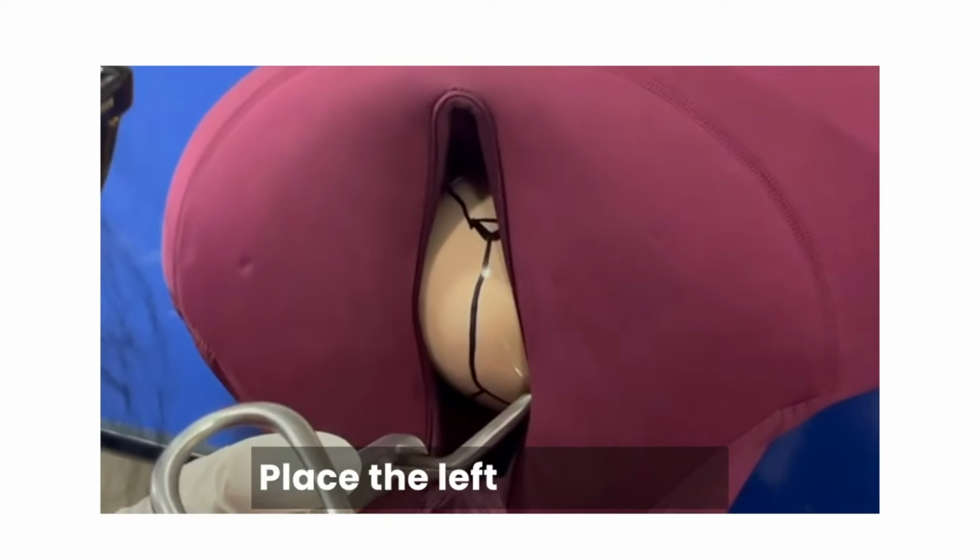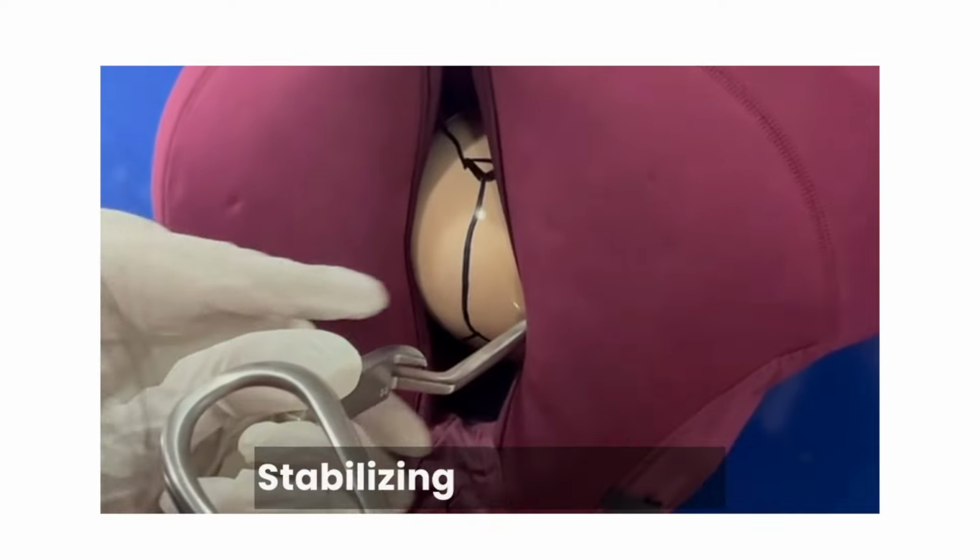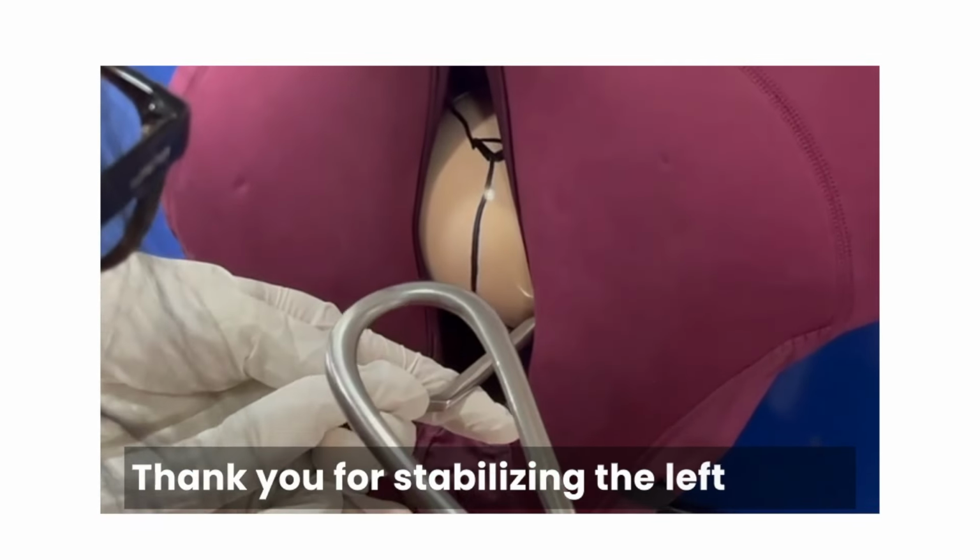Placed the left blade. Now I request Dr. Ramya, can you stabilize the left blade? Yes, ma'am, stabilizing the left blade. Thank you for stabilizing the left blade.